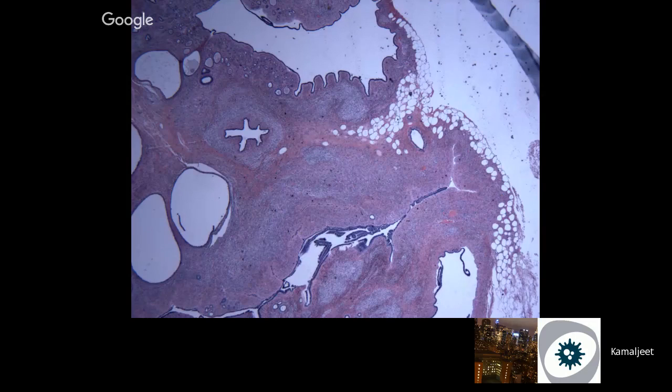One more important thing in evaluation of a fibroepithelial lesion is the border. In fibroadenoma, the borders are circumscribed. Benign phyllodes, the borders are circumscribed, pushing type. However, the moment you start seeing these permeated borders, where you see the stromal cells sneaking into the fat, it's a focally permeative lesion and you are at least at borderline phyllodes. There's no way you can go back to benign phyllodes.